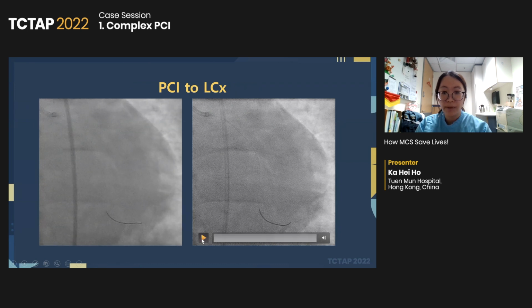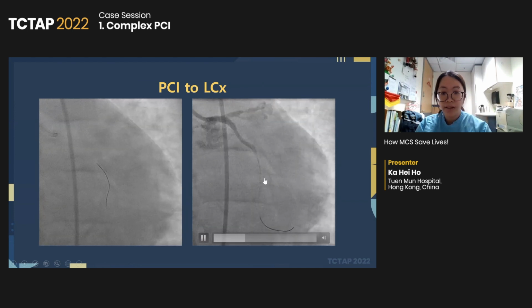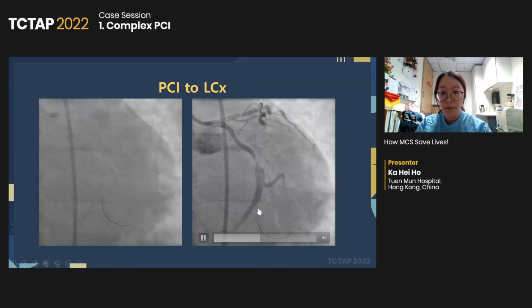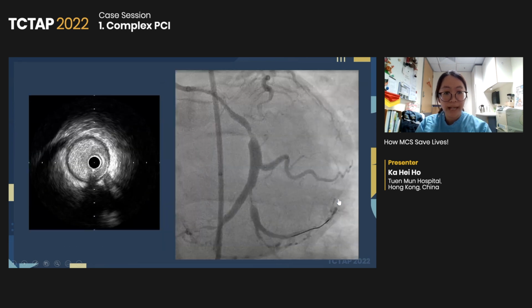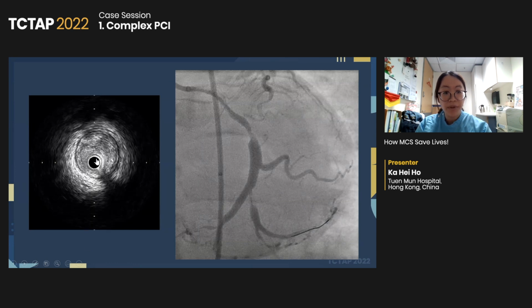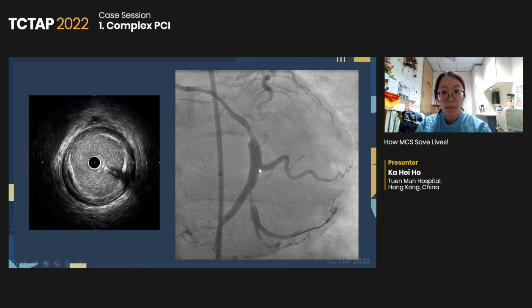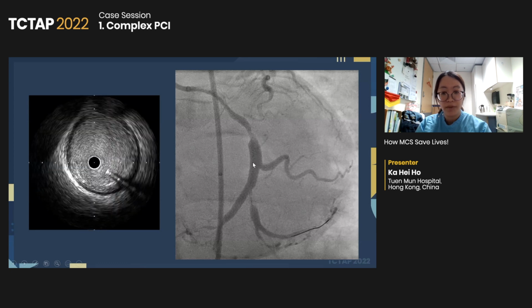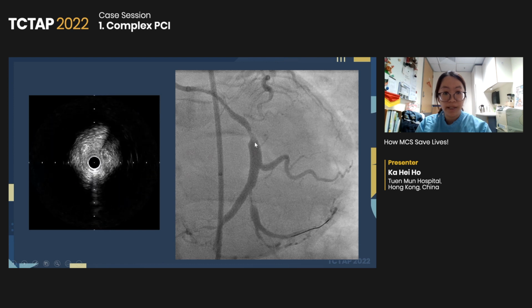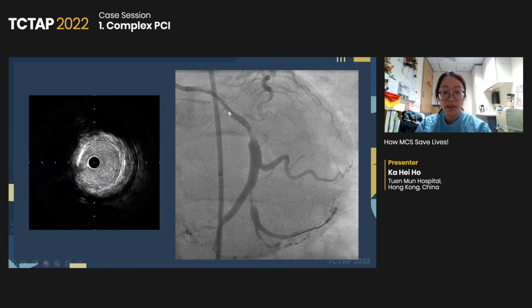This is the angiogram that we obtained after wiring. We can see there is an ectatic vessel over the middle distal third, tight stenosis over OM2, and we pre-dilated, and we did an IVUS. This is from the OM2, and we can see there's very severe stenosis here. And now we are in the normal segment in the mid-circumflex. And then we see another very severe stenosis here, and all the way up to the proximal circumflex.